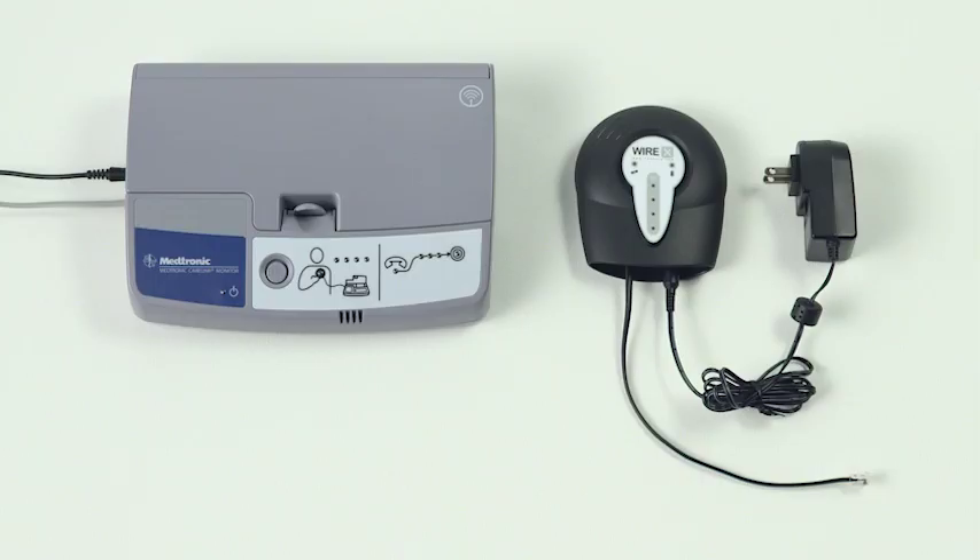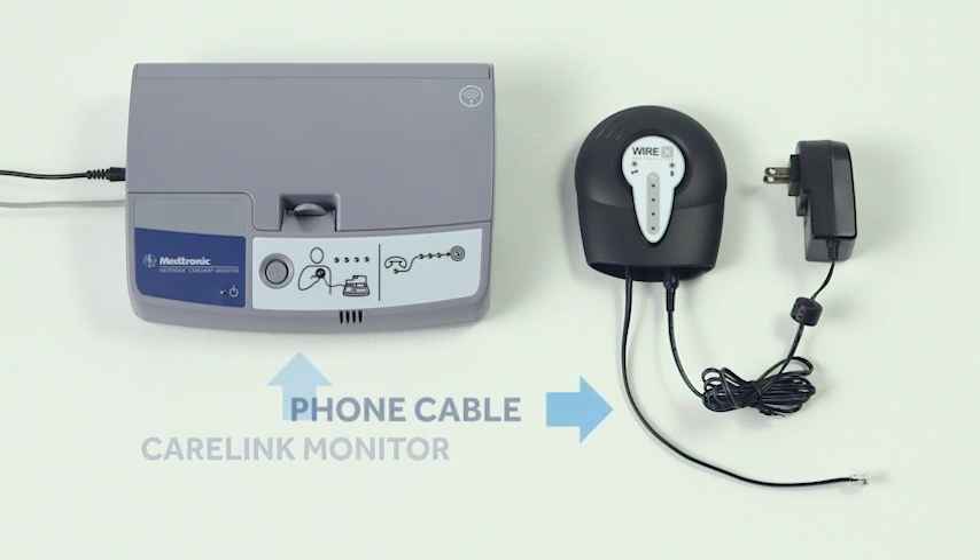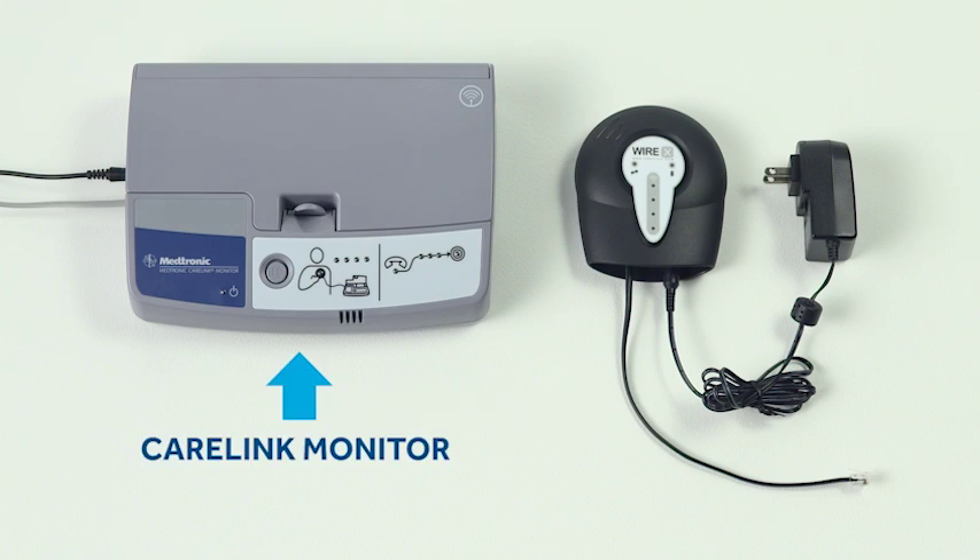So let's get started. We'll be working with these components: a cellular accessory, a power cord for the accessory, a short phone cable, and your CareLink monitor.